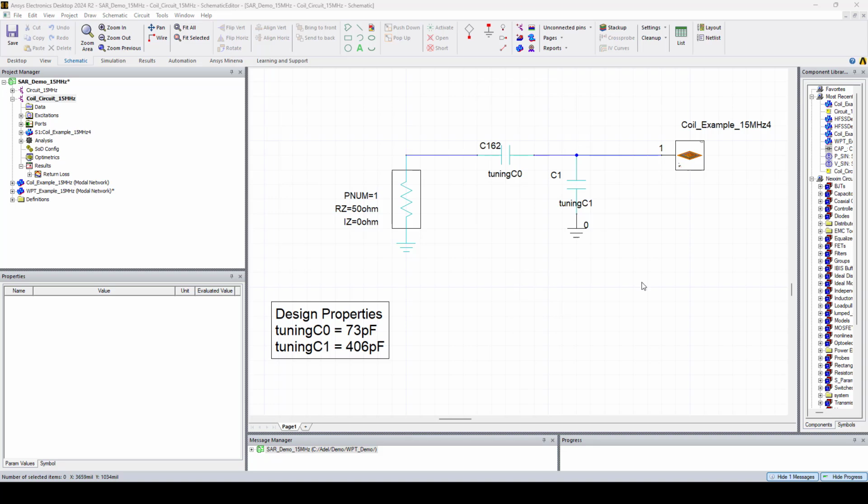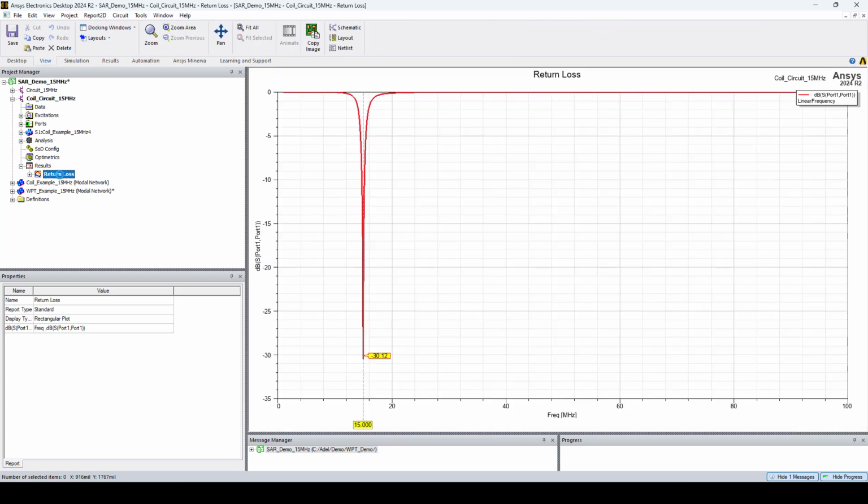Once the HFSS simulation of the coil is complete, it is linked to a circuit where tuning capacitors are added and tuned to achieve resonance at 15 MHz. So here I added two tuning capacitors and I tuned them using the tuning feature in circuit. And here you can see the return loss, which is better than minus 30 dB at 15 MHz.